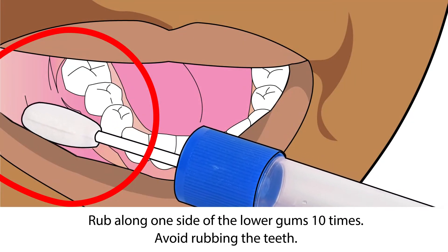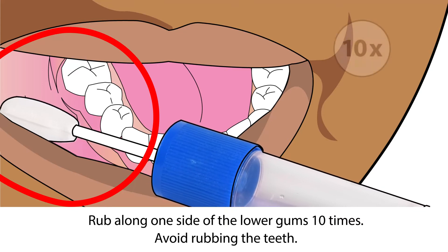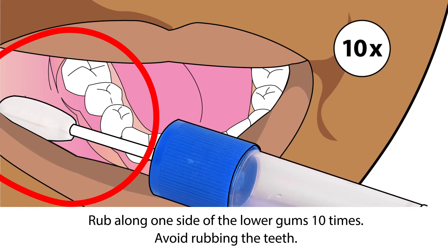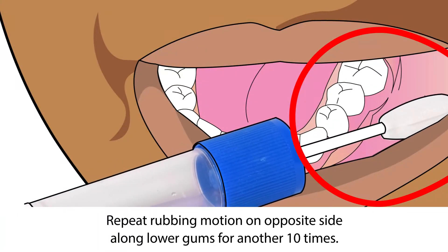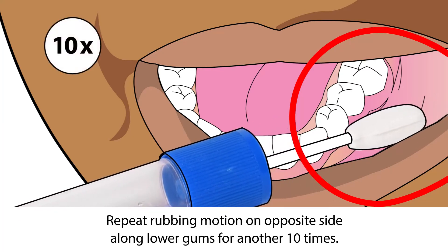Place the sponge in the cheek pouch and rub along the lower gums in a back and forth motion, repeating the motion 10 times. Once complete, transfer the sponge to the opposite side of the mouth and gently repeat the rubbing motion for an additional 10 times.